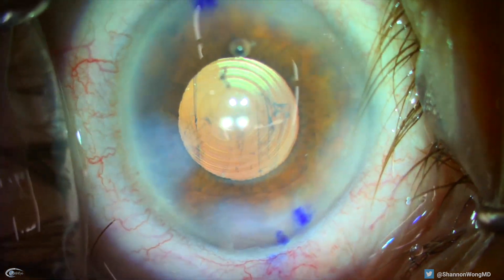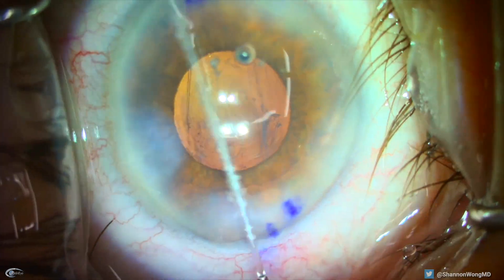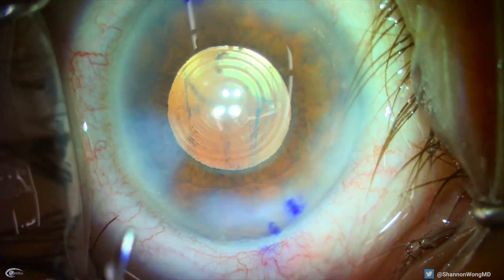Finally, we nudge the IOL into ideal alignment and centration and inspect the corneal incisions to make sure that they are watertight. This is the view of this patient's eye one day after surgery. The IOL is perfectly centered.